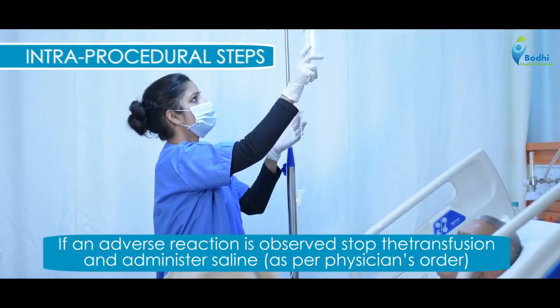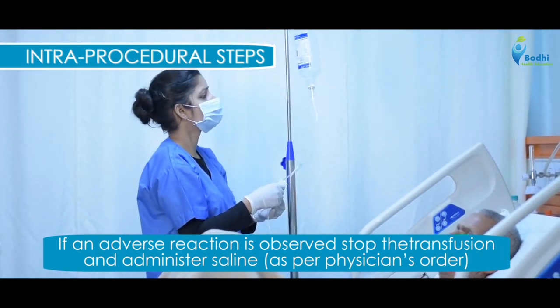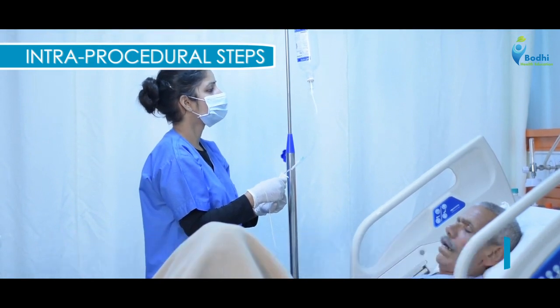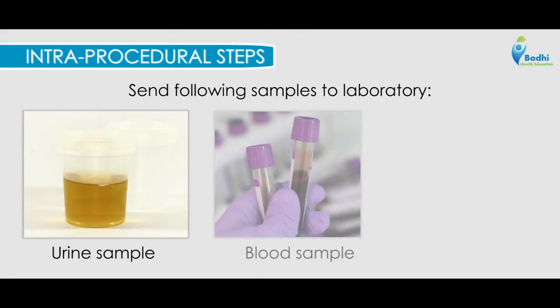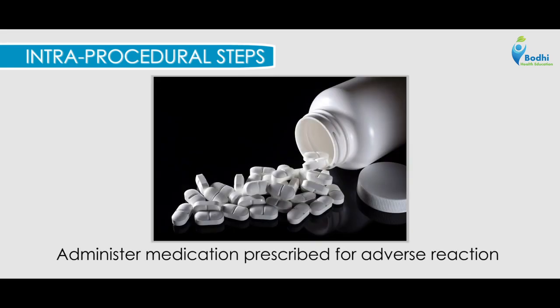If an adverse reaction is observed, stop the transfusion and administer saline or as per physician order. Send urine sample, blood sample and remaining blood product in container with transfusion set back to the blood bank. Taking urine sample and blood sample helps in confirming transfusion reactions and comparison from baseline data. Administer medication prescribed for adverse reaction.